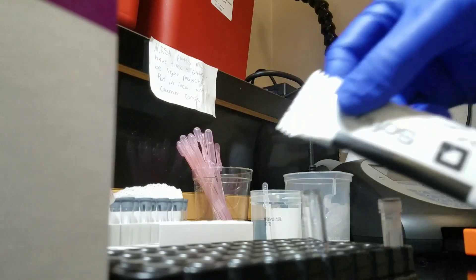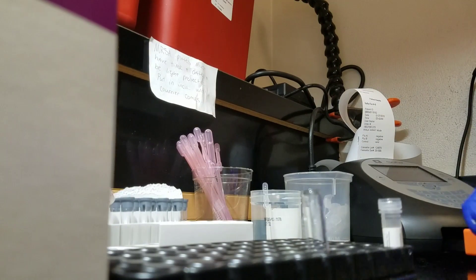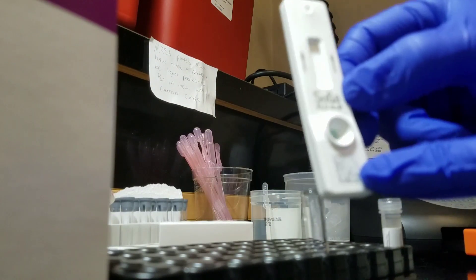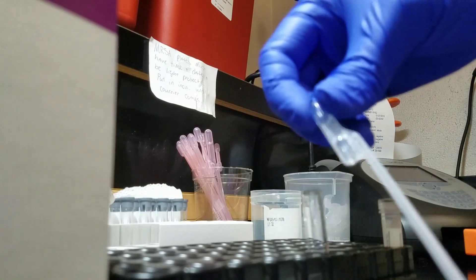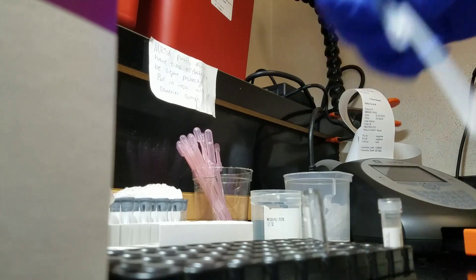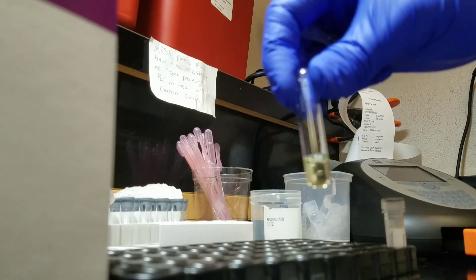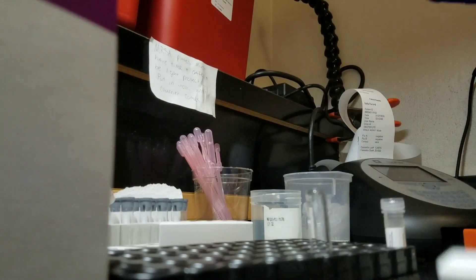Now that it's all shook up, we have our reagent cartridge. We'll open that up — here's what it looks like. There's a unique little barcode that's on all of them.